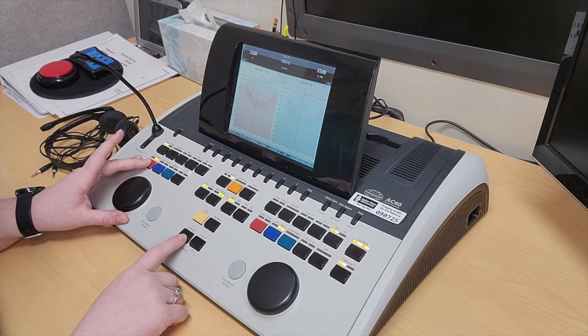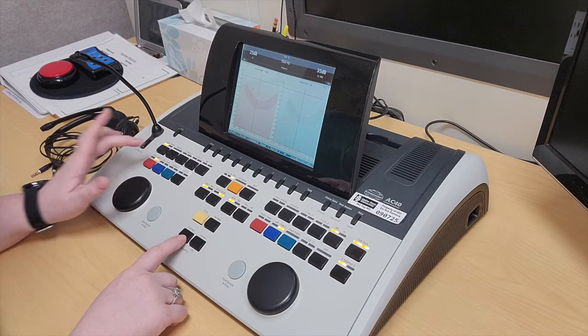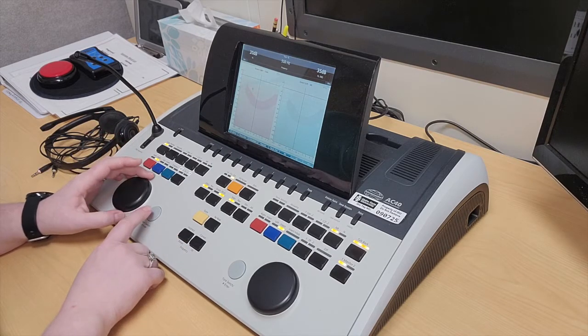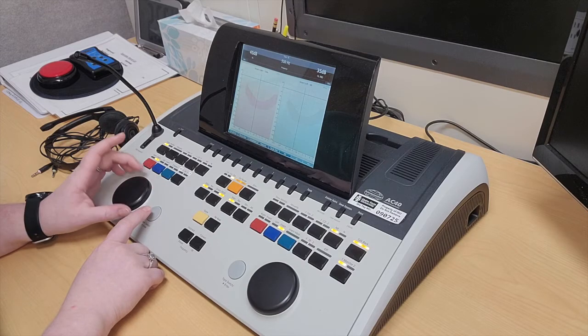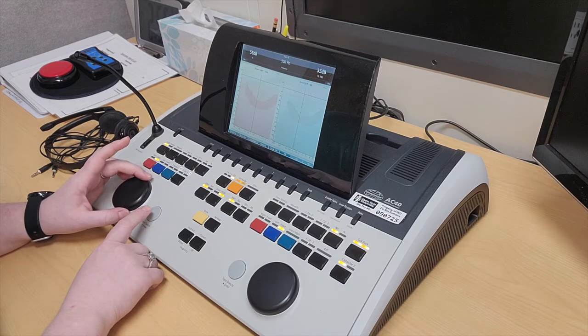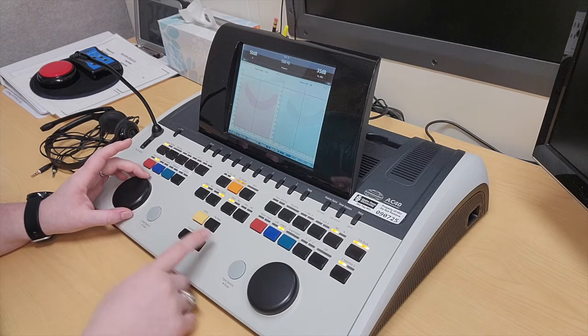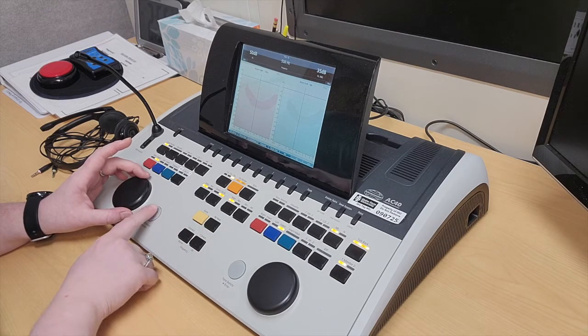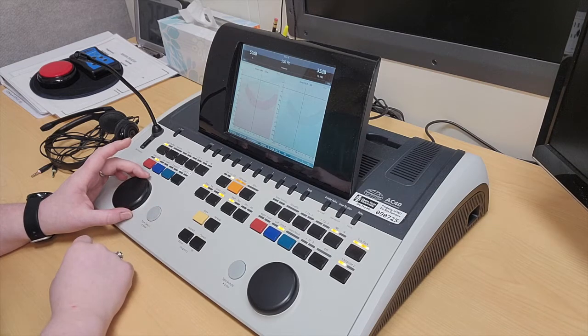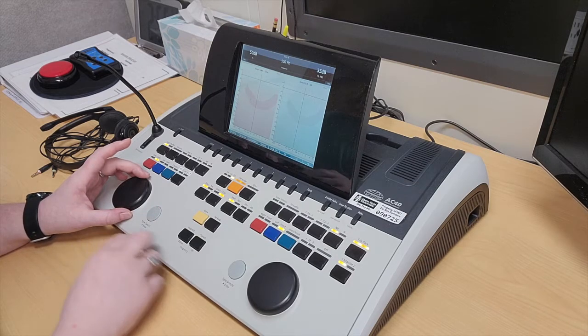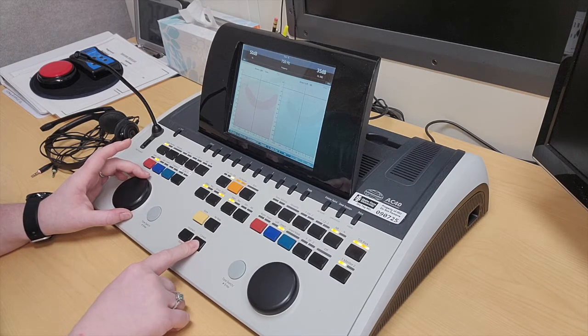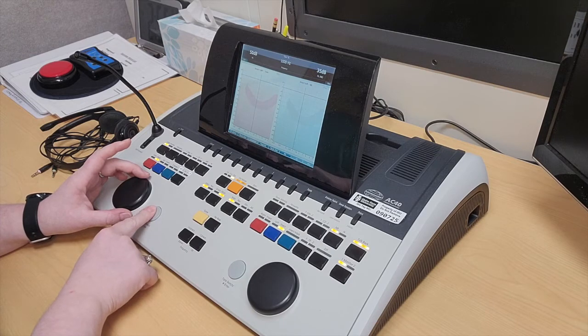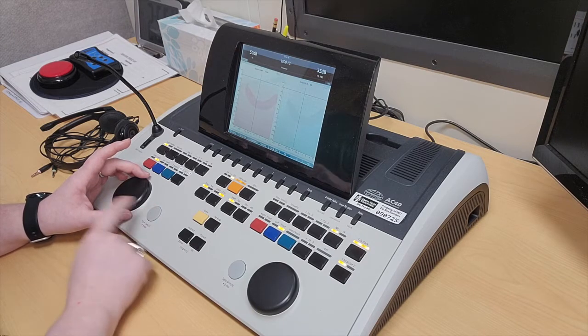We are currently on the right ear insert at 500 Hz. I'm at 50 dB, present, and it does a few beeps. If I wanted to go up to 1000 Hz, I can navigate there and present a few beeps.